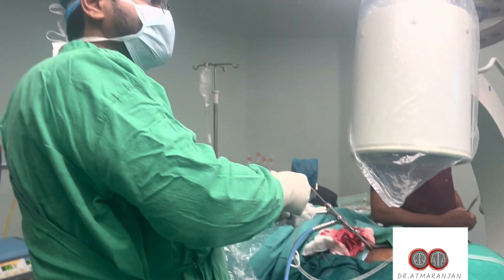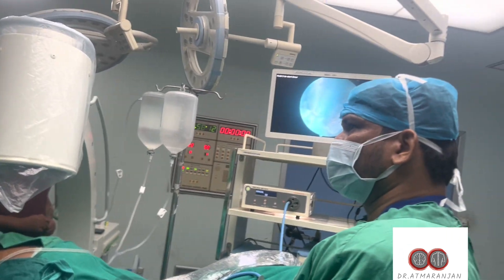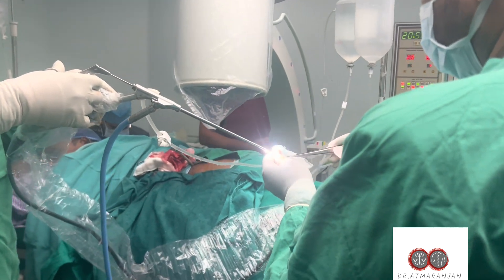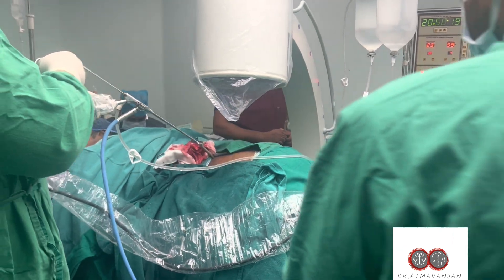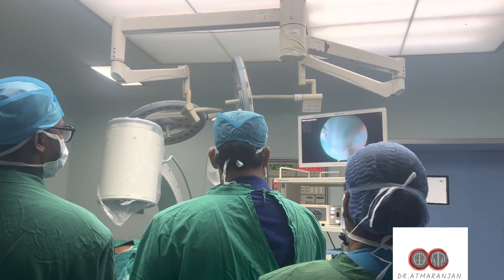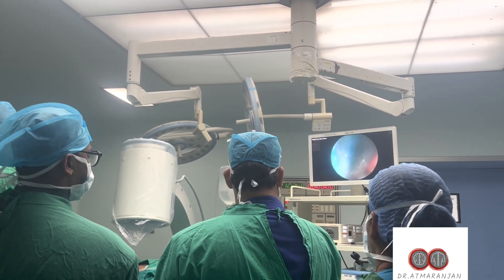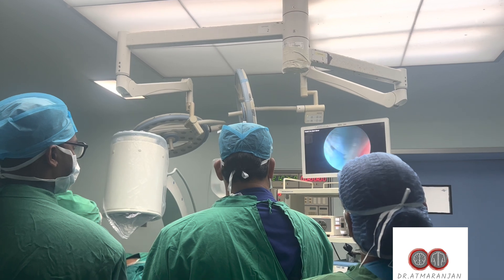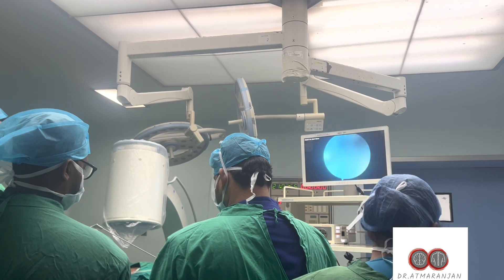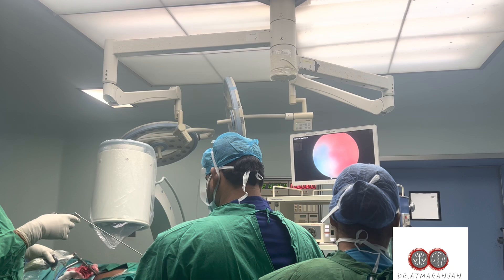We are using radiofrequency ablators in this case for hemostatic purposes. The beauty of this surgery is that it is a daycare procedure — the patient comes to the operating theatre in a walking condition and goes out in a walking condition. The patient is discharged on the same day of surgery and is able to walk and is pain-free within minutes of the procedure.